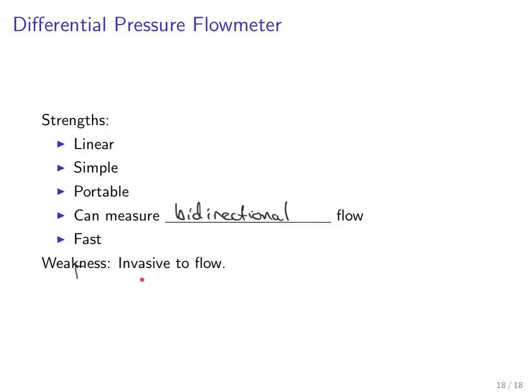The weakness, of course, is that these are invasive to the flow. So you try to minimize the resistance that the subject is going to experience in blowing through them.